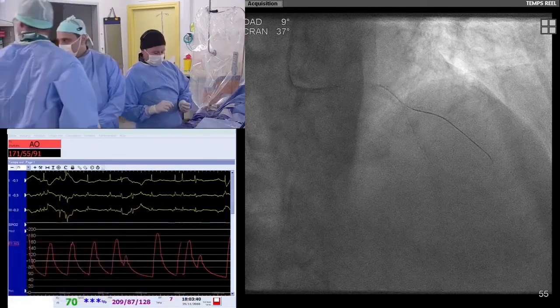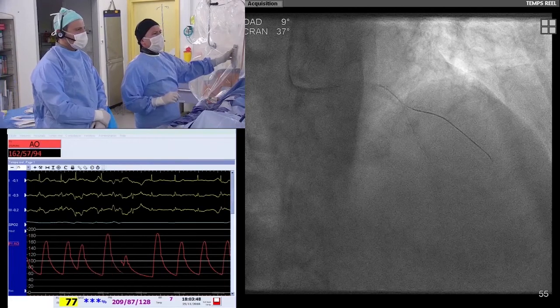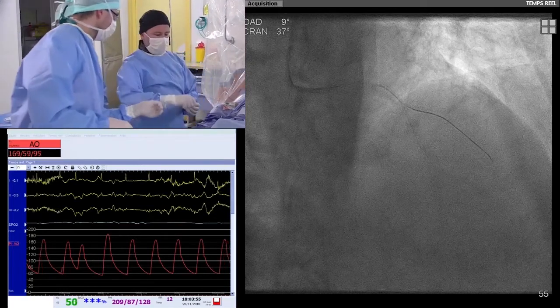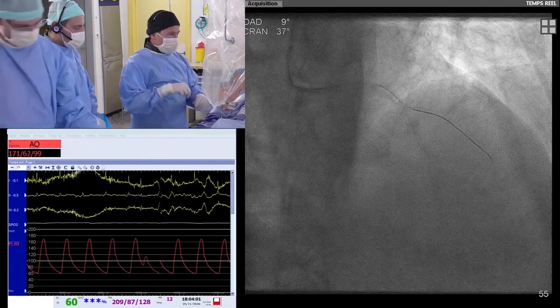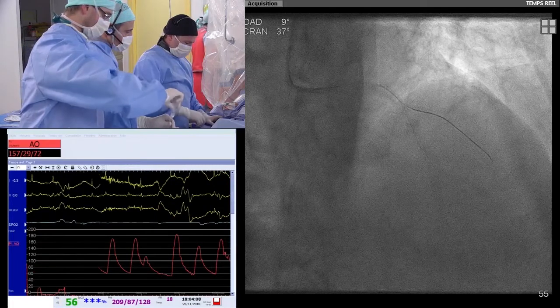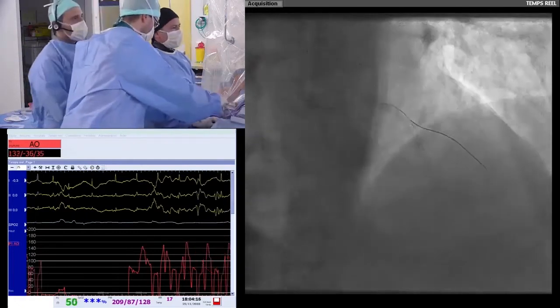Because the 4.0 Synergy is easier to post-dilate at more than 5 mm. I think this is a quite huge left main, more than 5 mm, and we'll do a post dilatation using a 5.0 balloon inside the ostial and mid left main. So I use a long stent. I repeat the size. Diameter is 4.0 and the length is 48.